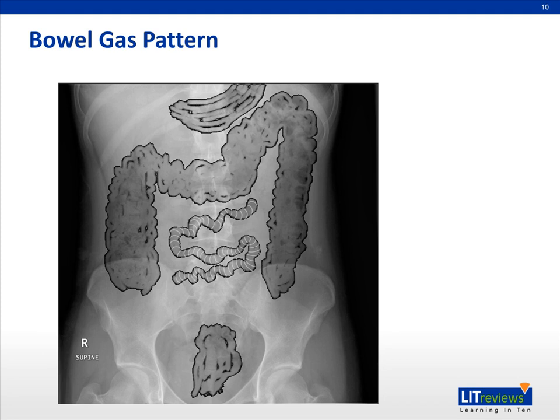The 3-6-9 rule: the diameter for small bowel will be 3 cm, large bowel 6 cm, with the exception of the caecum that can go all the way up to 9 cm.